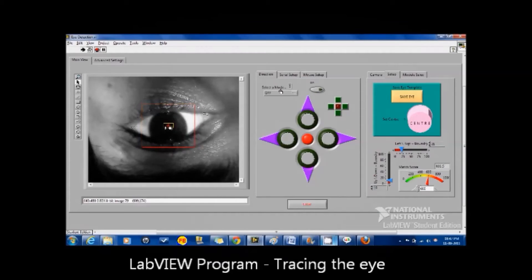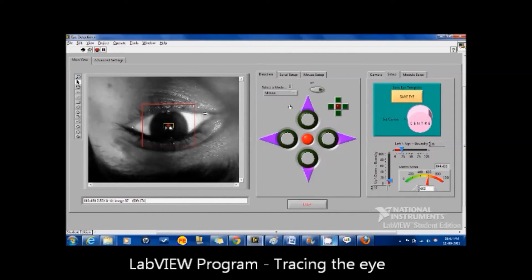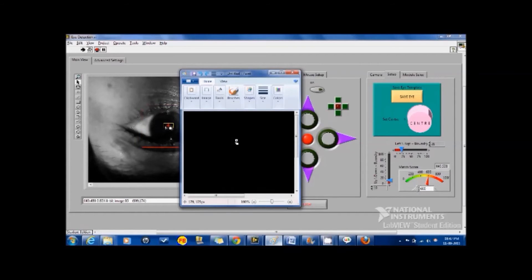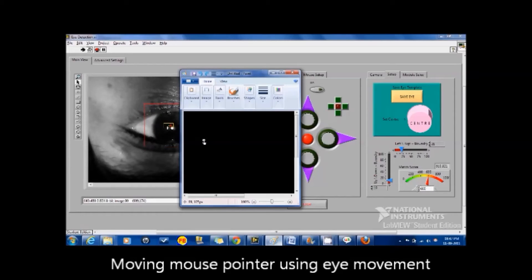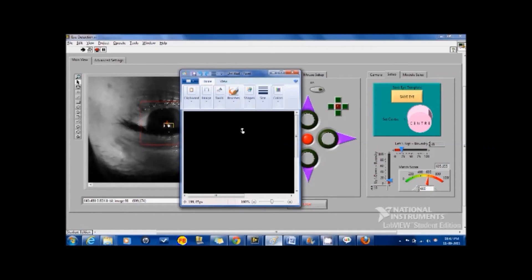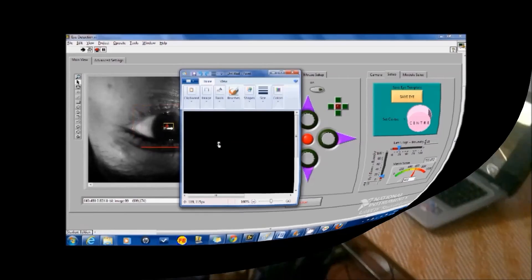Eye movements can also be used to operate the computer. For example, the cursor can be moved around just by looking at the screen. Other functions using eye movements include typing using a virtual keyboard, making emergency calls, and playing games.